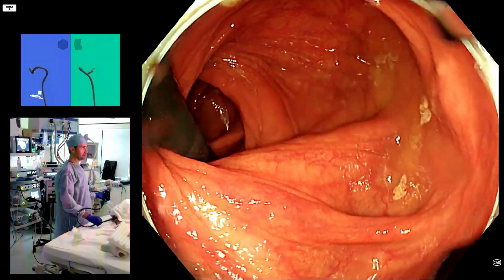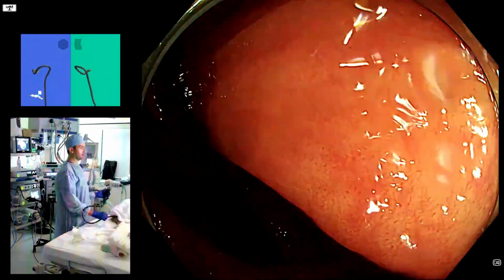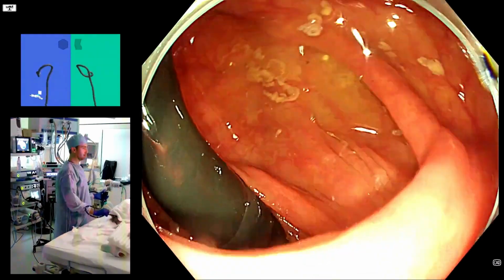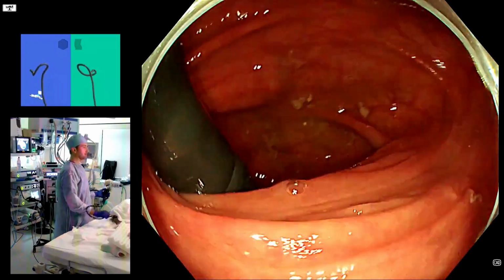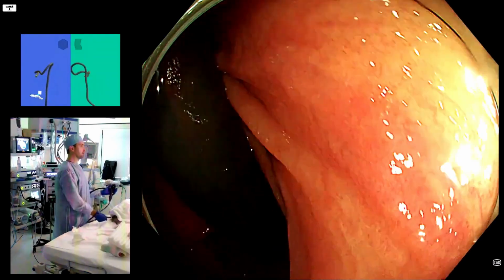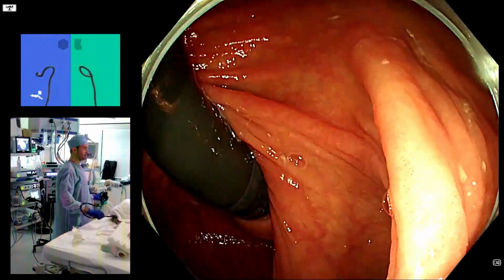We can just do that by sitting on the water jet, and I saw a little detection there, but maybe that was nothing. Okay. So again, we didn't see so much doing that, but we did find one extra little polyp that we should at some point remove, depending, of course, on the patient and their comorbidity and everything else.